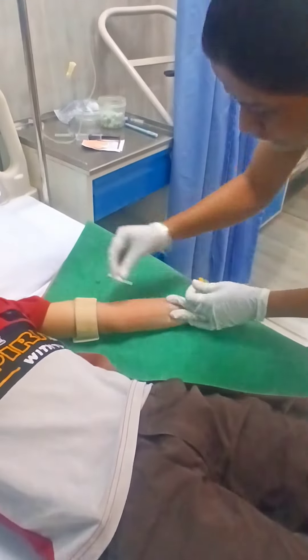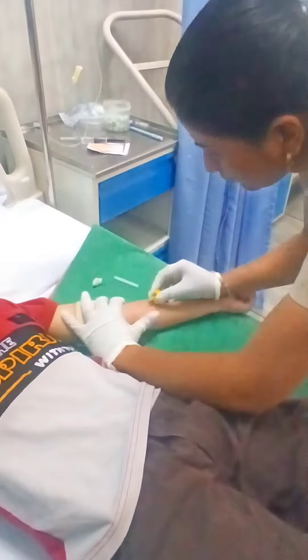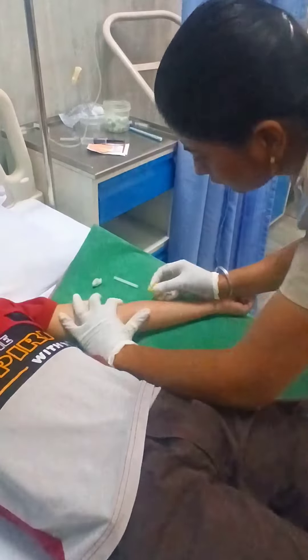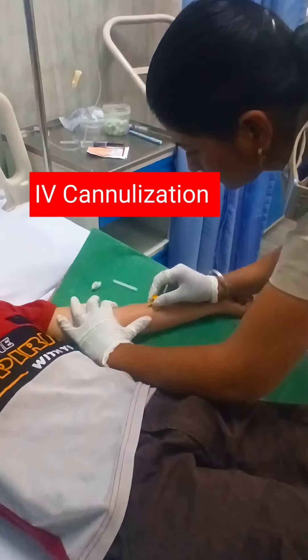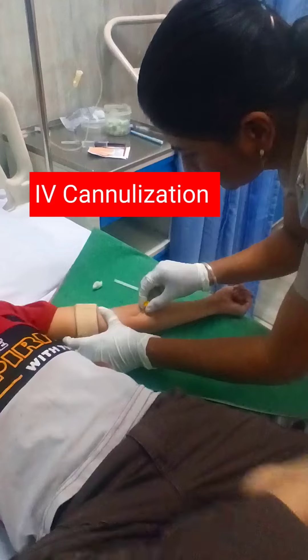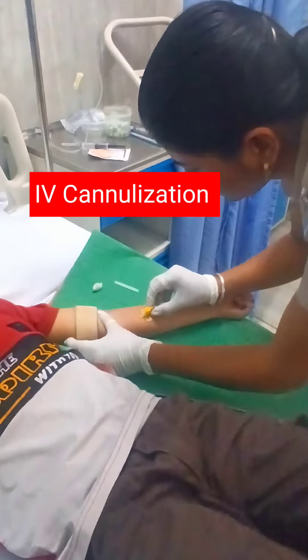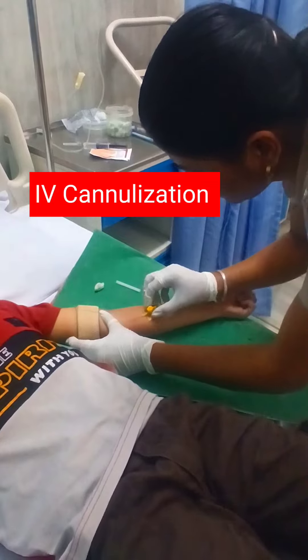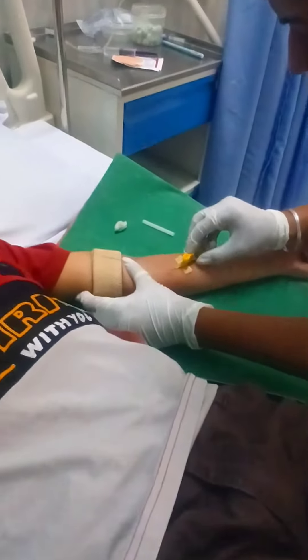Here are some important points for single prick cannula insertion. First, wrap a tourniquet above the site of insertion to dilate the vein. Second, instruct your patient to do fist clenching. Third, you can use a warm towel over the area of insertion for several minutes — about 10 minutes. The warmer temperature enables the vein to dilate and makes it more visible.